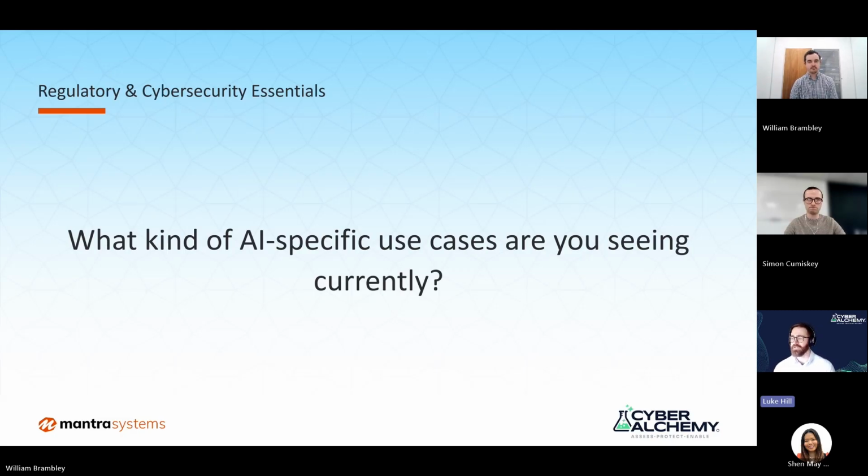Obviously, accuracy is of critical importance, right? Where the difference of just a single word, if the scribe missed the word "not," for example, like you have not broken your arm, it's quite a big difference in terms of how that patient should then be looked after, but also around the data residency and that sort of stuff as well. There's all sorts of different nuance and challenges.